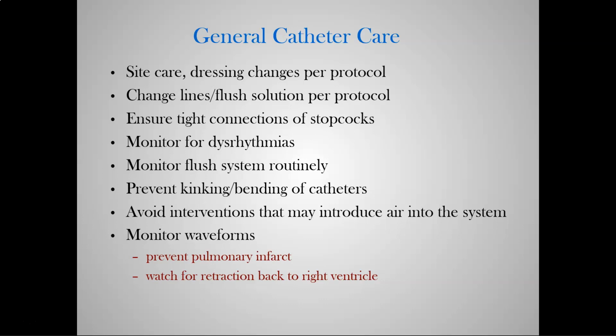Okay. I'm just making you aware of the fact that if you see some baby air bubbles in the line, do not panic. Do not freak out. If you see large sections of air bubbles, yes, those need to come out. Absolutely. Okay. Monitor your waveforms all the time. All right.